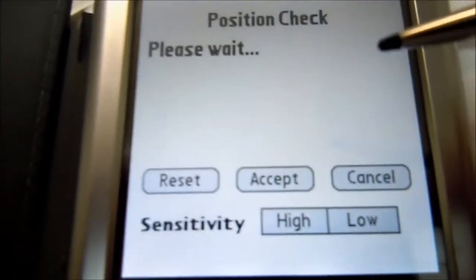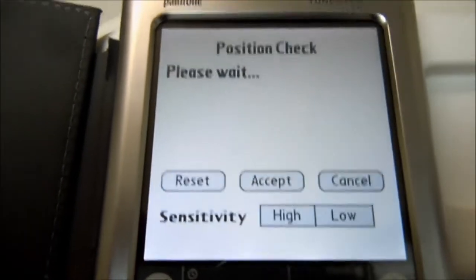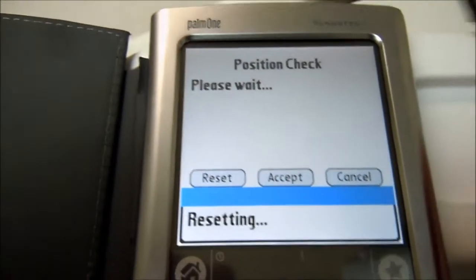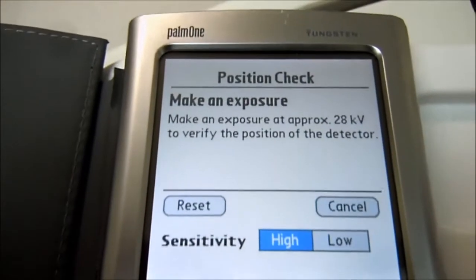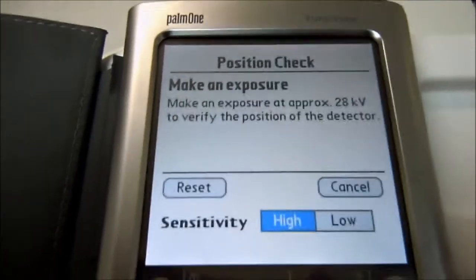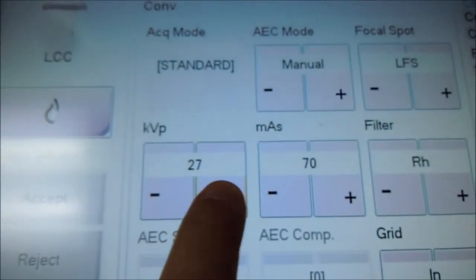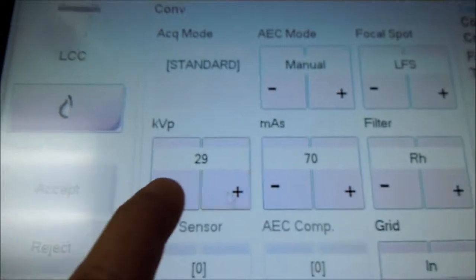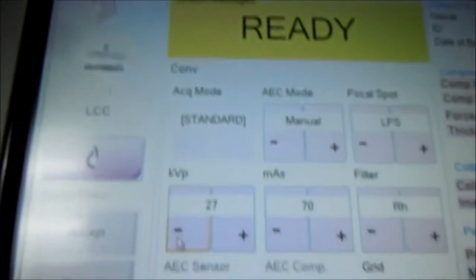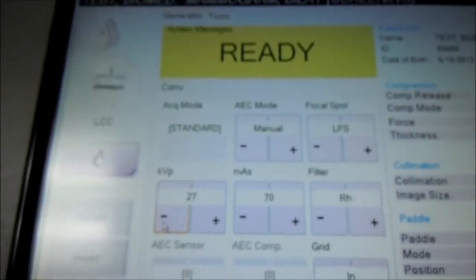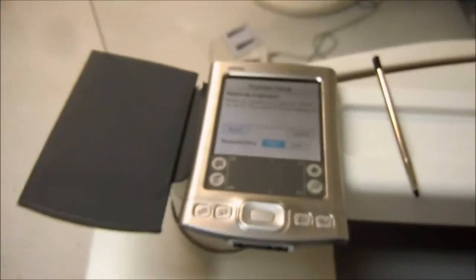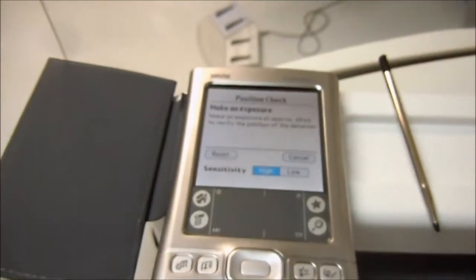Changing the filter. Right now it's asking us to do a position check, which we're going to have to make an exposure at 28 KV to verify the position detector. We're going to change this back to 28 KV. And I'm going to make an exposure. I'm going to pause the video because I need both hands.